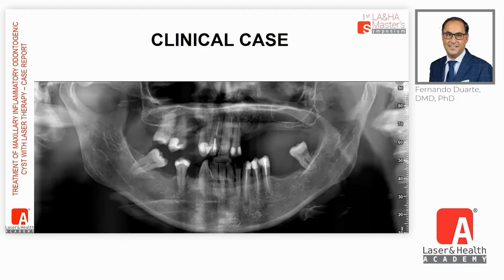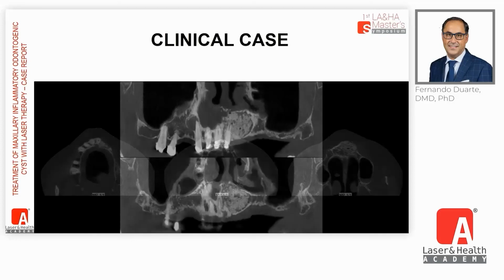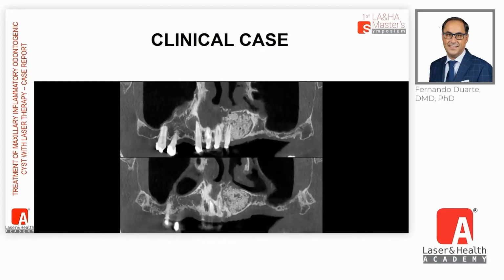Now, let's see the final result. From the OPG post-op, you can see that the bone reconstruction was well done, and the post-op CT scan also shows us that we managed to remove all the cysts and also to achieve a good bone reconstruction. The biomaterial is very compact and fulfilling all the cavity. After 4 months, our colleague will be able to place the dental implant.